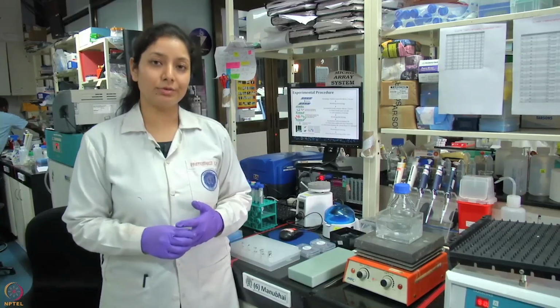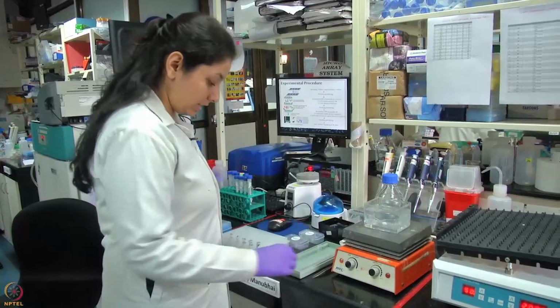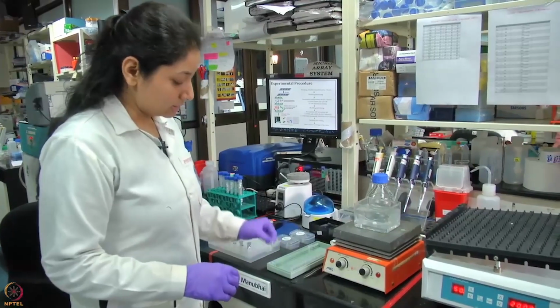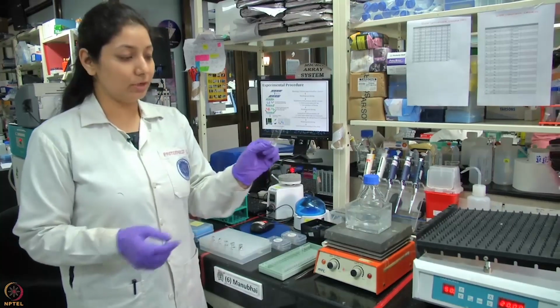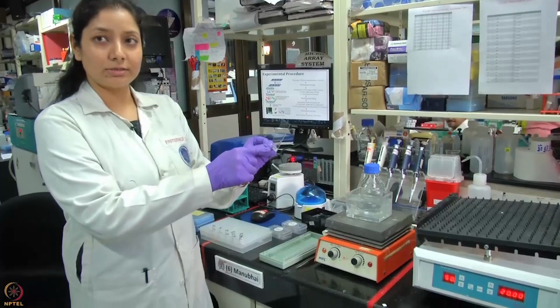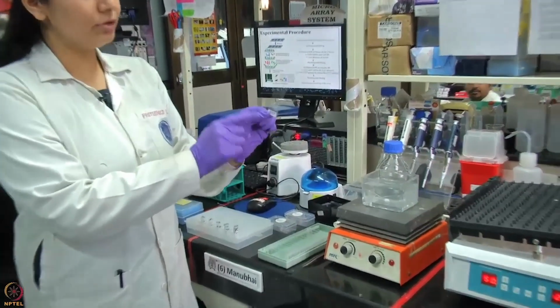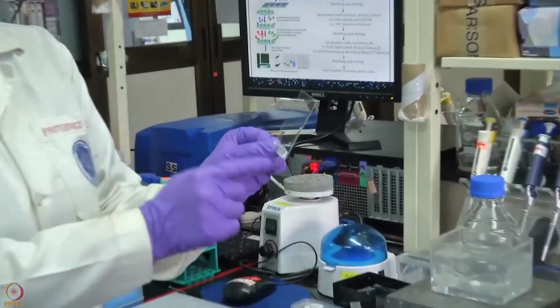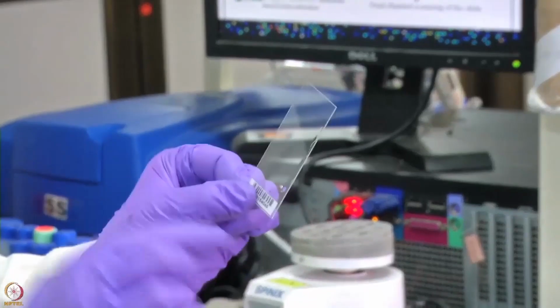Now let's move on to the hands-on experiment of how autoantibodies are detected using protein microarray. This is how the slide looks, a normal glass slide which contains 19,000 protein spots. This is the area where the spots are printed in duplicates. This is the area where the barcode is present, and you cannot touch the slide where the spots are present. You have to touch the slide here only.